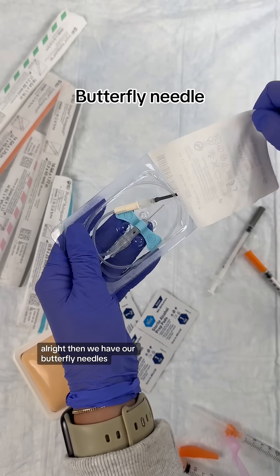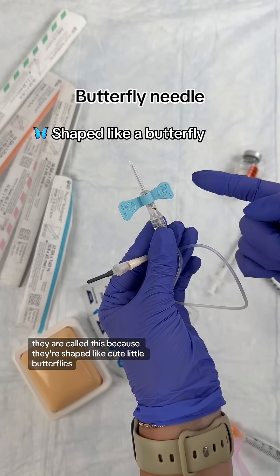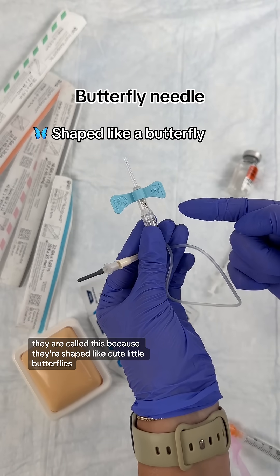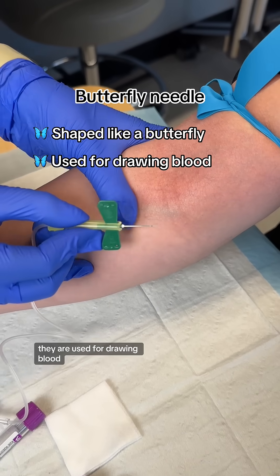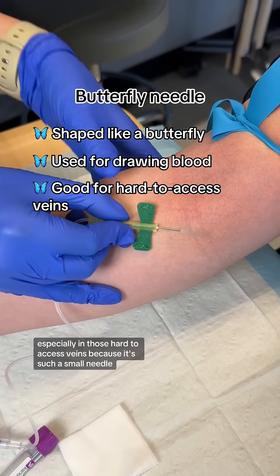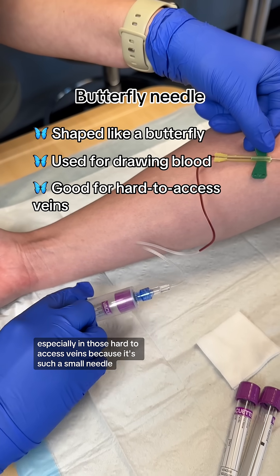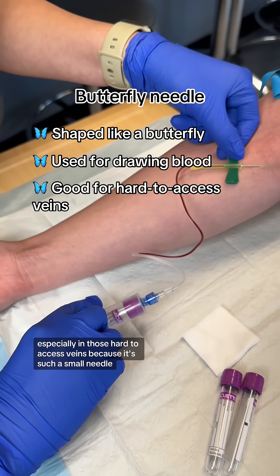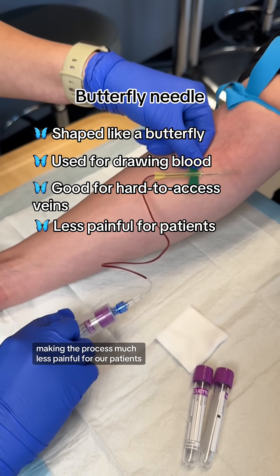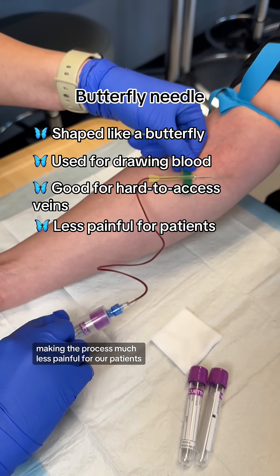Then we have our butterfly needles. They are called this because they're shaped like cute little butterflies. They are used for drawing blood, especially in those hard-to-access veins, because it's such a small needle, making the process much less painful for our patients.